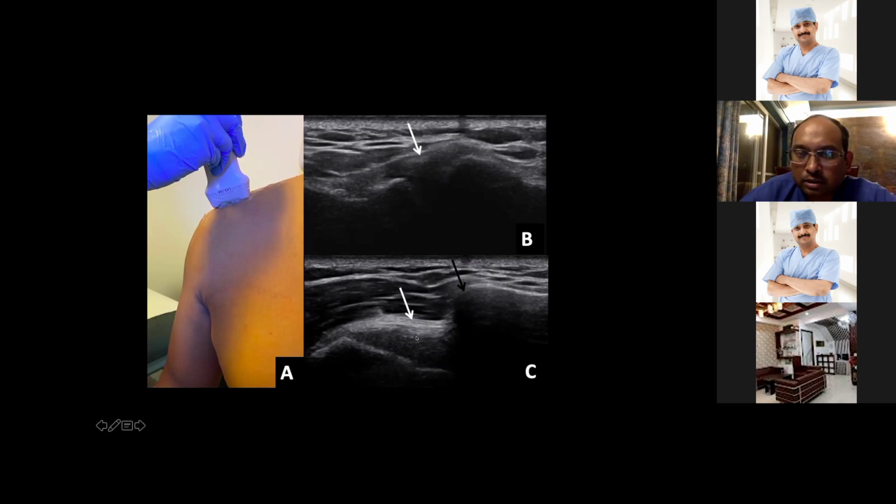So in this talk today, I am just focusing on the normal anatomy and normal structures, how we do see. As we move on with other radiological pathologies of the shoulder, I will be showing you all these pathologies.